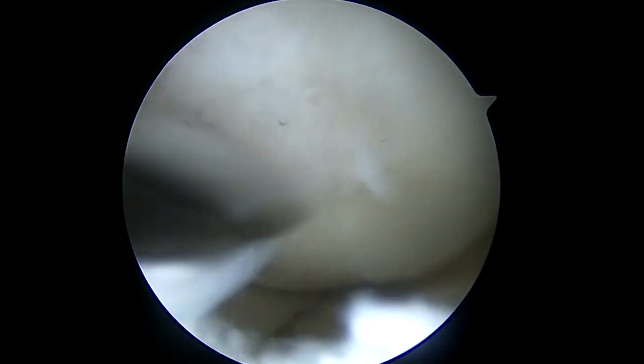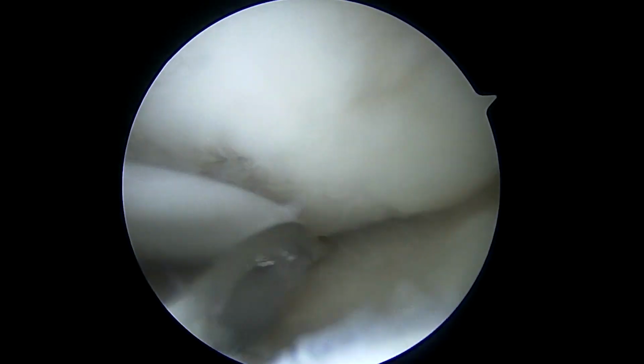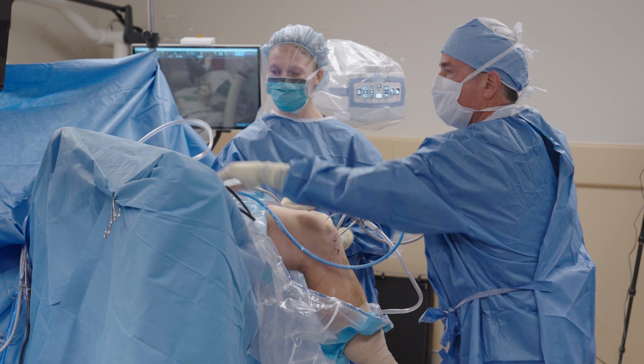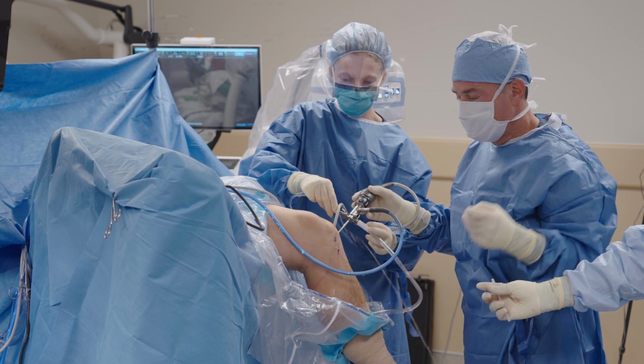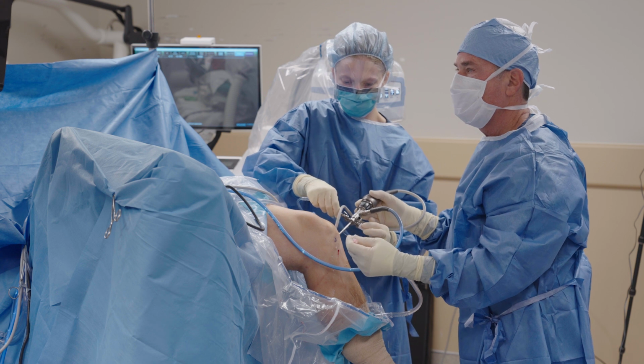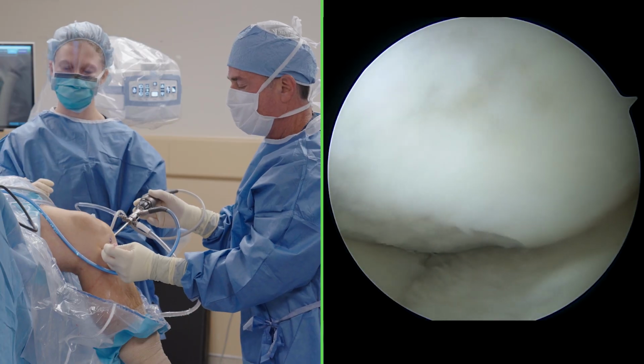So as I look at this, I'm planning out mentally as far as how many pins to use. I suspect I'll do 2 in the tibia and 2 in the femur, and I'll space them out about 1 centimeter apart. The other thing that I found particularly useful is to line up the intra-articular pathology with where I know the MRI findings are, just to verify and confirm.